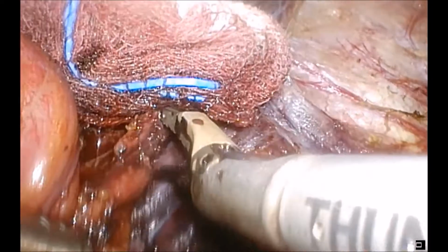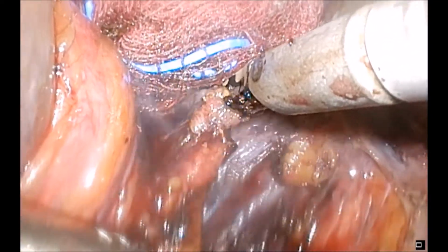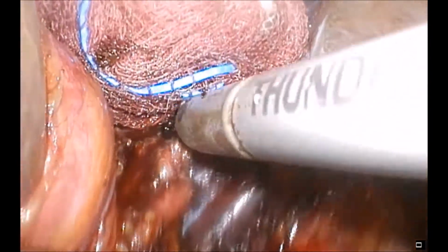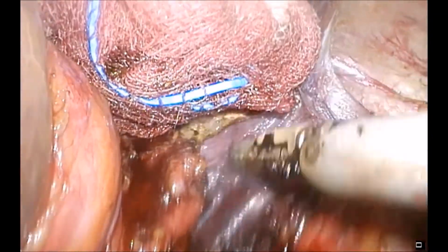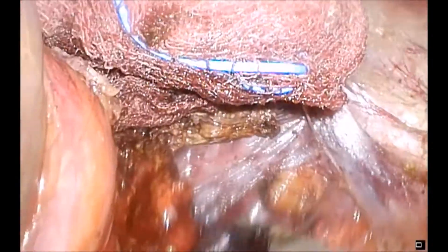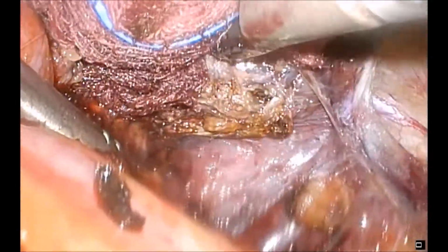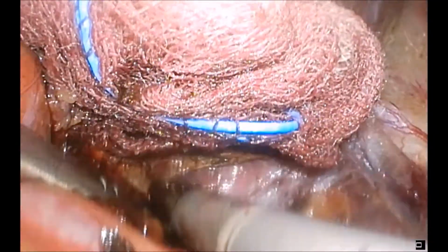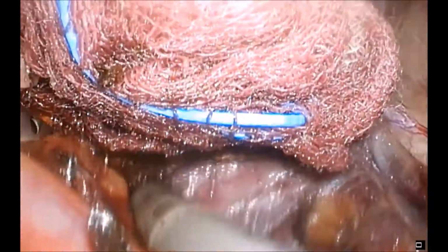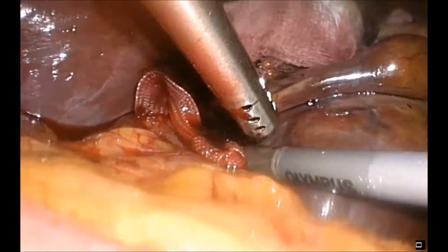So we're able to, using the laparoscope, pass safely in front of the vena cava and develop that plane very nicely. The superior attachments of the caudate lobe are now being divided, and that dissection's continuing further, again somewhat hampered by the replaced hepatic artery, but nonetheless we were able to preserve that.